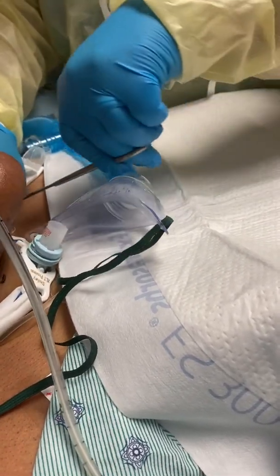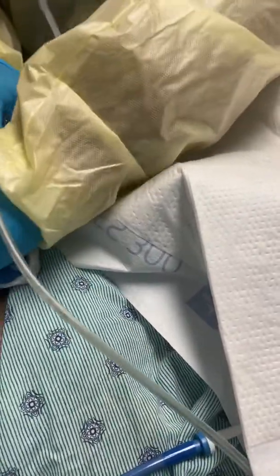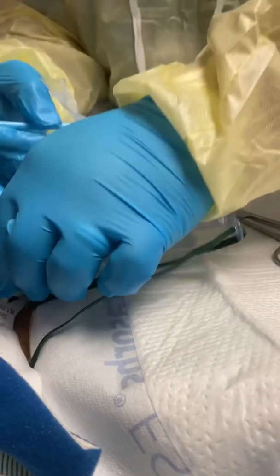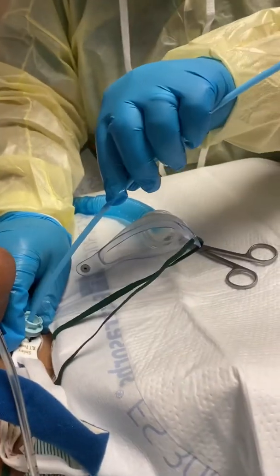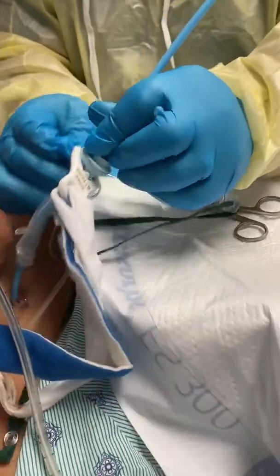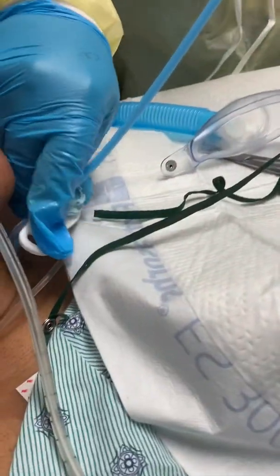Now I'm going to cut just a piece of the ties — that's all I'm doing. Take the inner cannula out. I didn't get the inner cannula — that's all right. And the bougie. A little pressure. All right, here we go — pull the old one out. Here comes the new one. You're all done there.